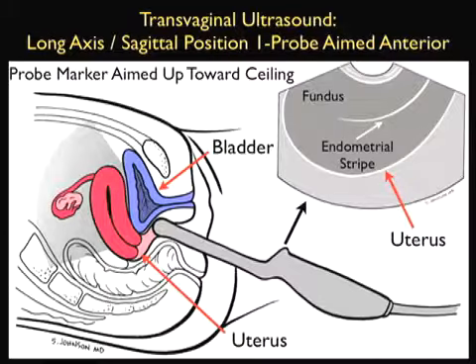We can see here the bladder immediately anterior to the female uterus, and recall that for this examination we want to have a completely evacuated bladder, a small bladder, so as best to image the female uterus. We see the resulting ultrasound image to the right. Notice that we have a better cut looking through the top part of the uterus, i.e. the fundus, and we can see the endometrial stripe, that white line arching down from fundus towards cervix.